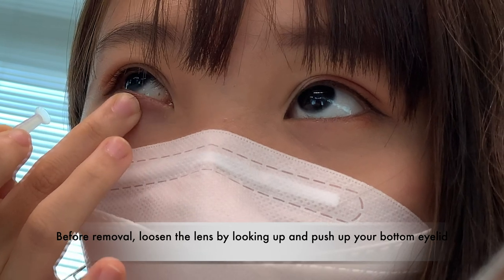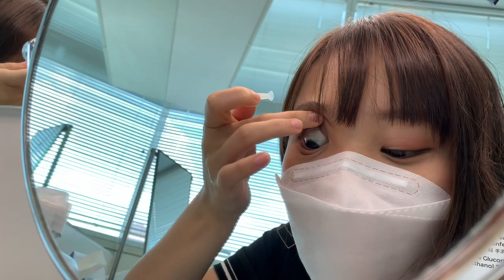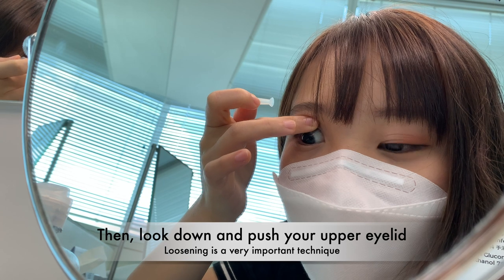Before removing the lens, loosen it by looking up and pushing your bottom eyelid, and then look down and push down your upper eyelid.